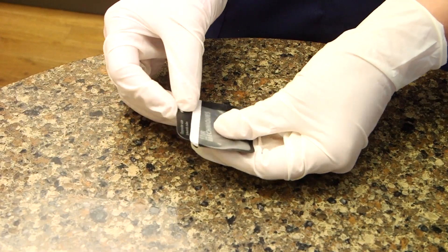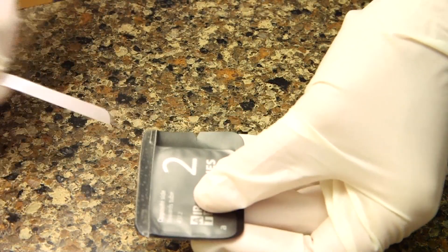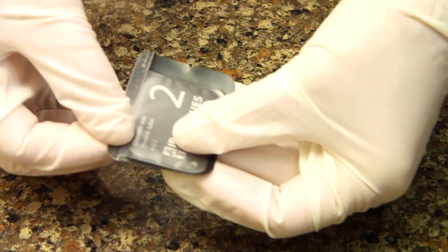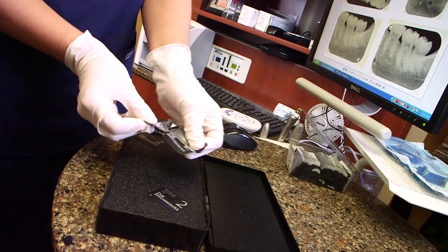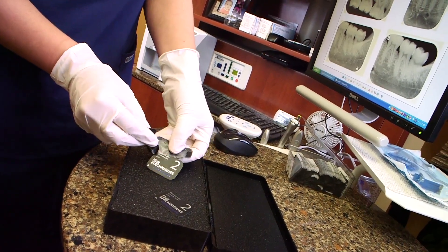Before exposure, PSP sensors are placed into barrier envelopes, providing a protective barrier. My patients are protected by the disposable barrier envelopes that each PSP sensor is placed into. After the x-ray is taken, the sensor is removed from the envelope, placed into the transfer box, and the envelope is disposed of.